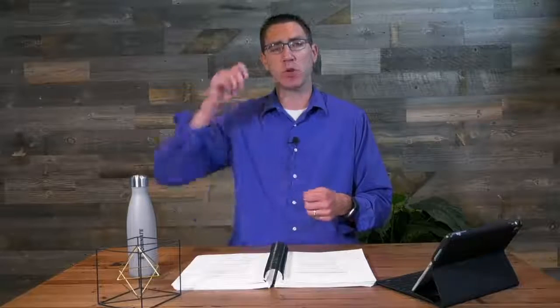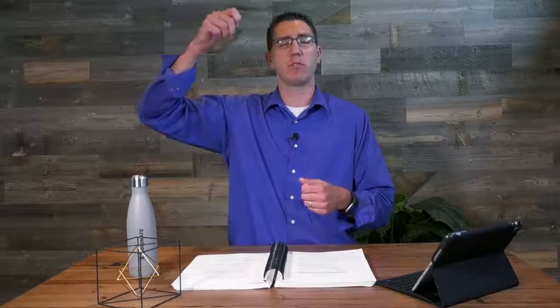So that's not necessarily in here in terms of an equation. So if you want to write out the side of this box, JND equals Snellen denominator divided by 100. I think that'll be kind of helpful there. So we do have the example in that box of a 20/400 patient. So what we would do is we take 400 divided by 100. You get a 4 diopter lens change, right? So what we can do is show them plus and minus 2 flippers, right? Because whenever we have the plus 2 in front of them, it will be 2 diopters over where they're at. And then we'll have the minus 2 in front of them. So we'll have a 4 diopter shift, right? We could also show them plano and plus 4 and plano and minus 4, right? Because that would be a 4 diopter shift as well.